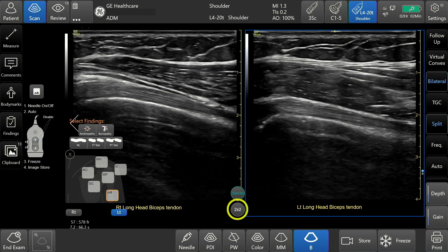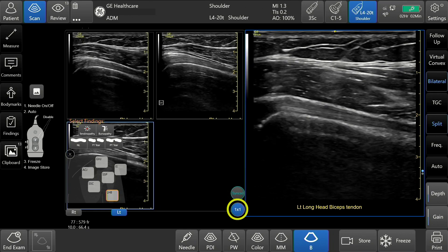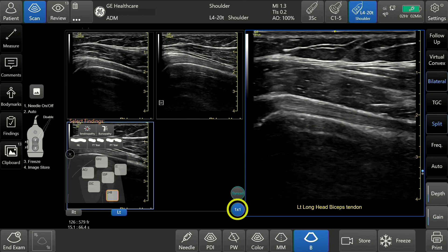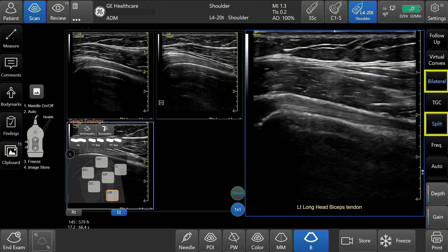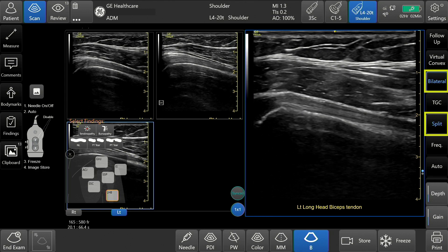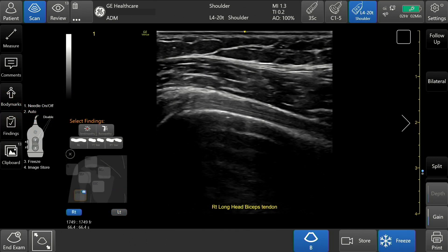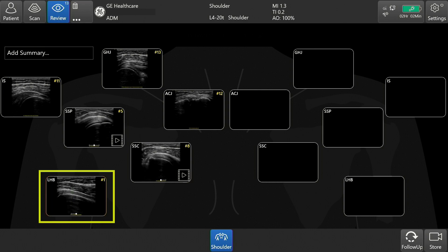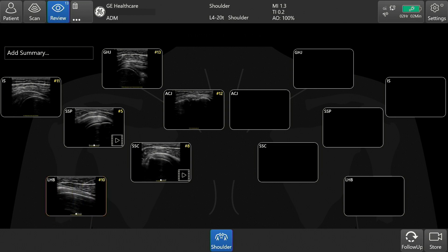2x2 allows the review of images from a previous exam by using the exact same image acquisition setup, side-by-side with a live image. To exit bilateral, tap bilateral or split. Tap Review to review the images. Stored video clips will display a movie reel icon in the bottom right corner. Multiple images for each zone can be captured. Swipe left or right within the zone box to display each image. To review an image from a particular zone, double-tap the image to enlarge to full screen.